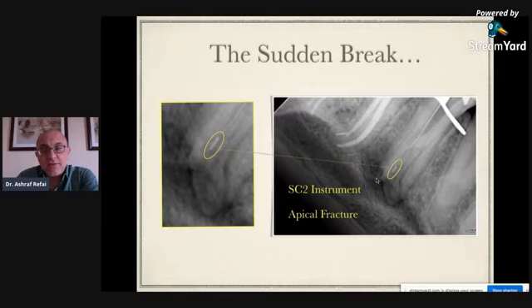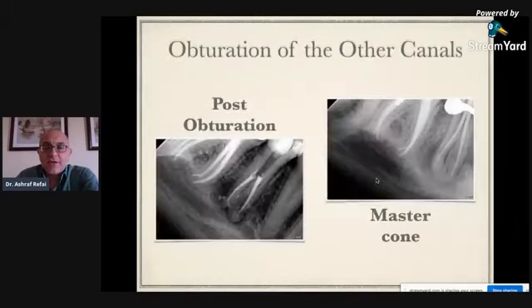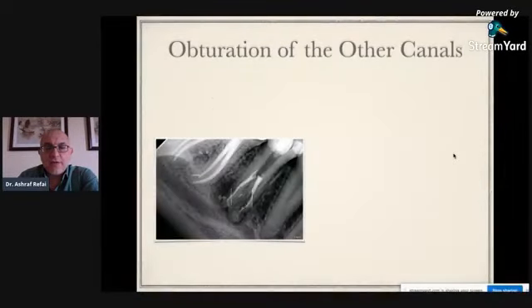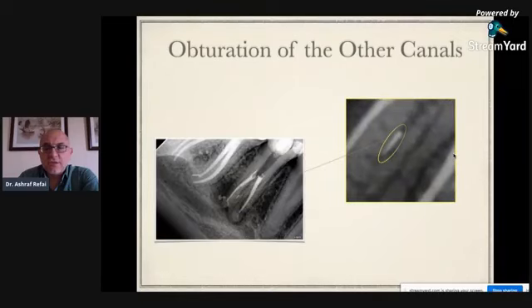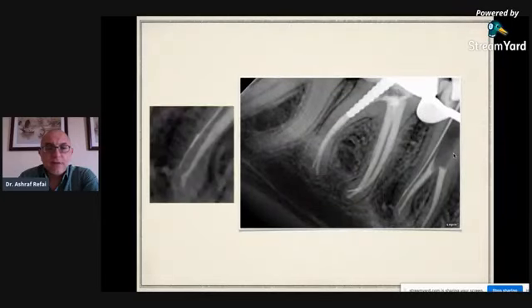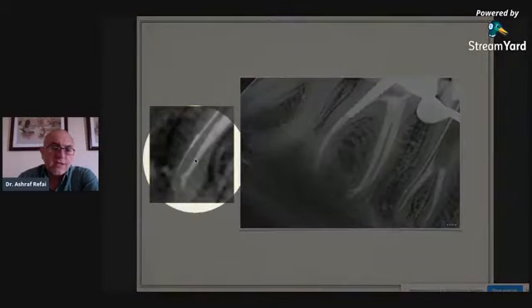So what we had here was a situation where, just as everybody else in these situations, I began to panic. I started sweating, and then I started thinking, how am I going to deal with this? So in this case, I started preparing and dealing with the other 2 canals first, and I had them obturated, and then I was left with this instrument. It was still there. So I attempted a bypass, and here you have an X-ray very clearly showing the bypass right here. That's the instrument, and that's my size 15 bypassing the instrument.